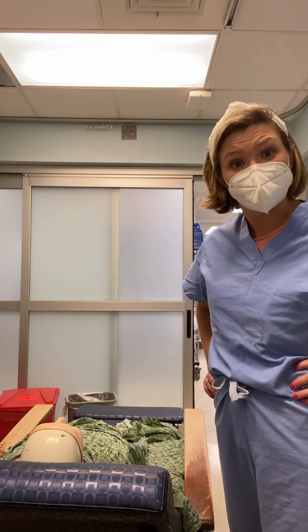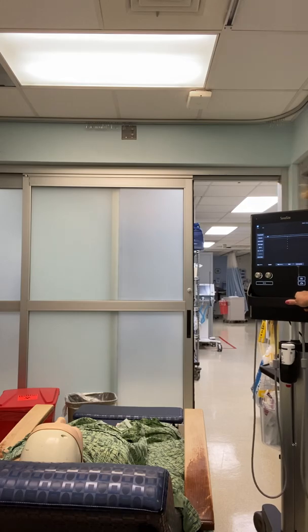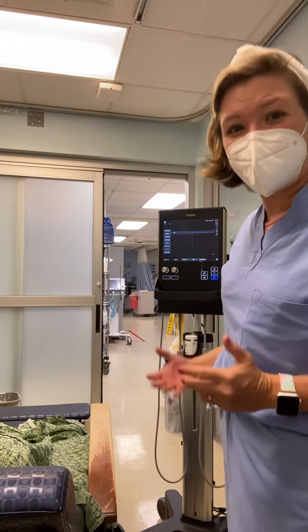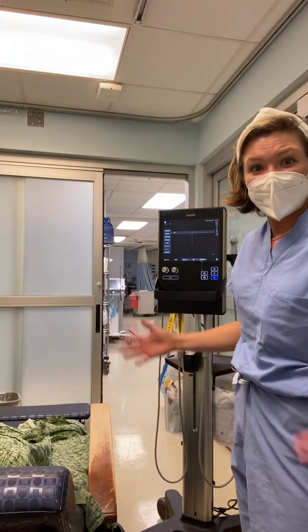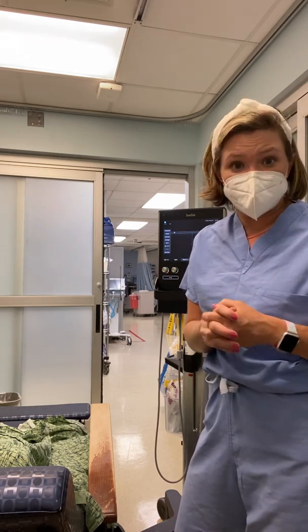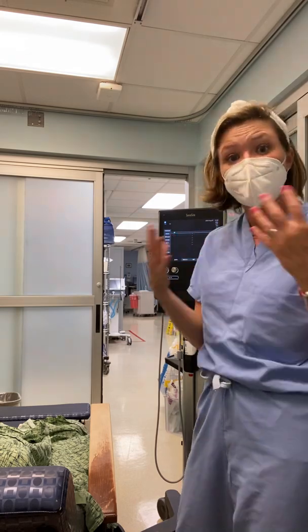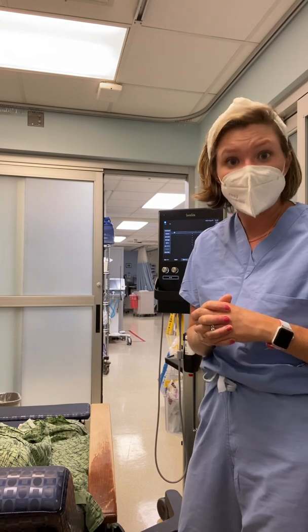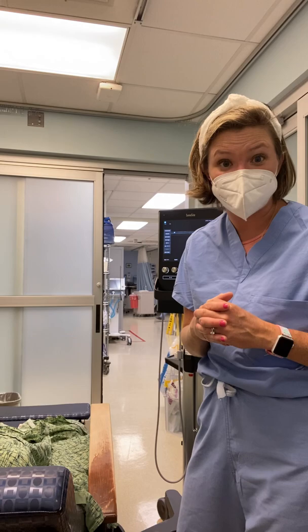One of the first steps that the nurse will do is set up the ultrasound machine. Our providers use this as the procedure is done under ultrasound guidance. Though I'm not going to have real patient information in here, I'll show you how we set this up. It's important to understand an Epic order drives a patient having the ability to appear in this machine. So at any point during the process, if we need to troubleshoot, we'll look for that Epic order titled US Guidance by Anesthesia.